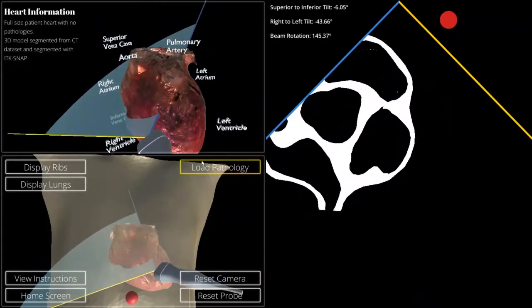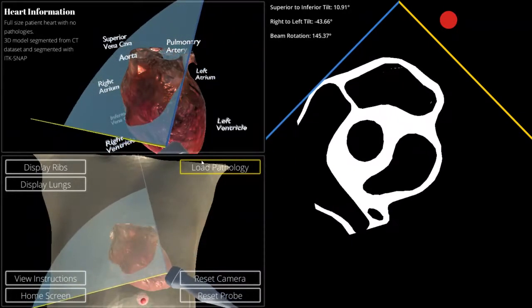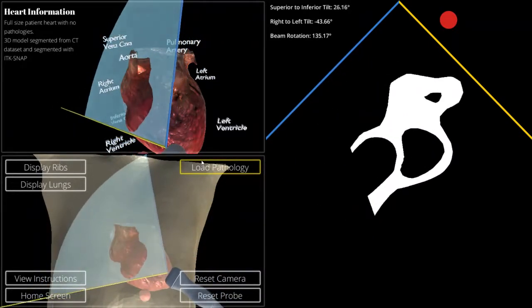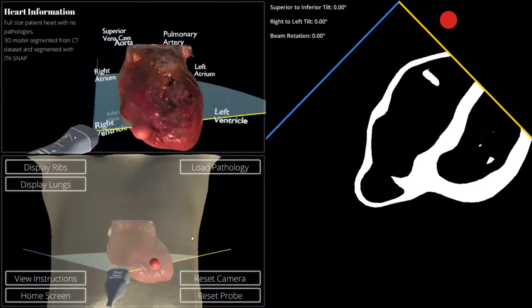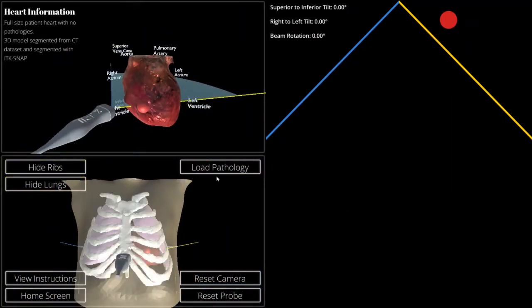So you can see what happens when we do an ultrasound exam without anything occluding it. We'll reset the probe here, reset the camera, and get the ribs and lungs back in.